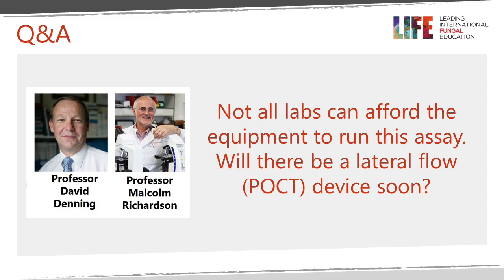And the actual paper that's used within the lateral flow assay may not be glucan-free. So I don't think we're going to see a glucan LFA in the foreseeable future. I think it's going to require a different sort of technology to have a rapid single-use assay.